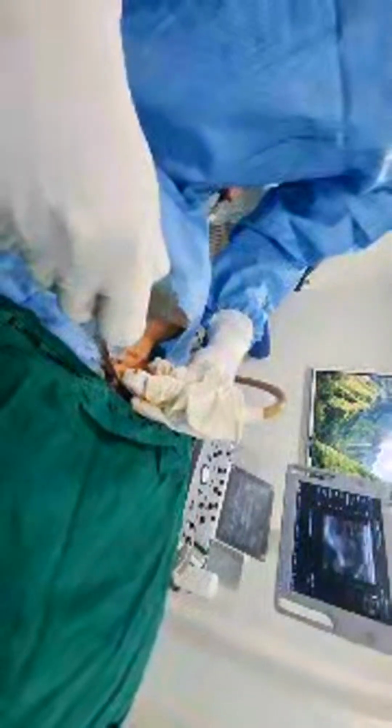After that, we have to infiltrate tumescent fluid between the thyroid capsule and the deep fascia. So this is the method. We are injecting with a small prick, and the patient will have a painless procedure.